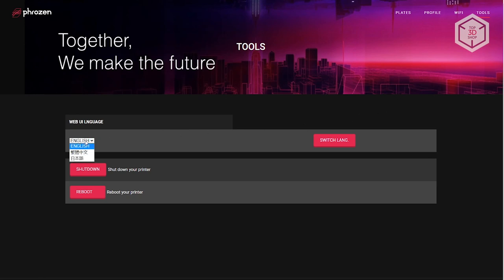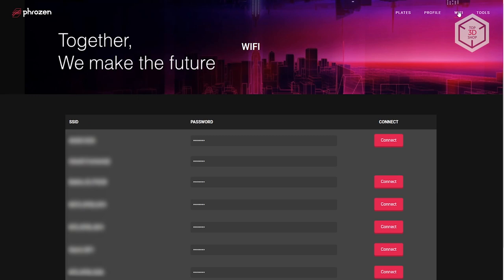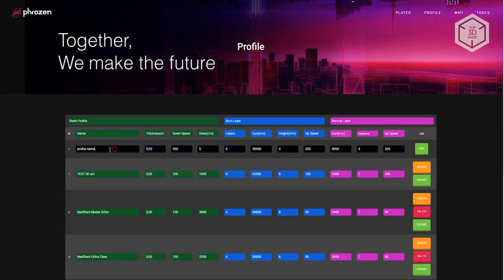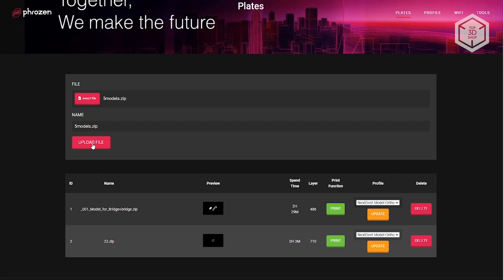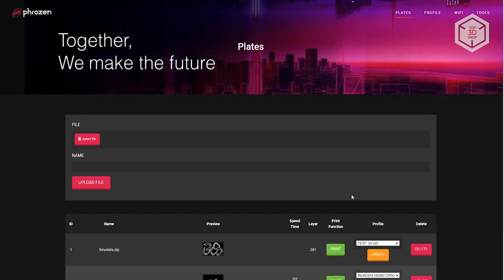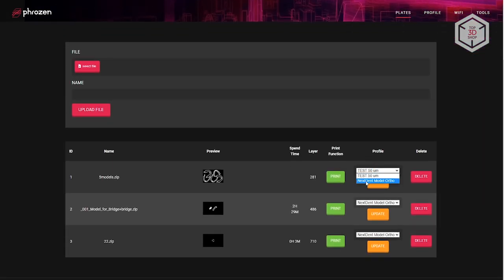The web interface contains four tabs. Tools allow you to change the language, turn off and restart the printer. The Wi-Fi menu lets you select and connect to a Wi-Fi network. Profile is responsible for creating, editing, and storing print profiles for different resins. And the Plates tab is used for loading sliced models into the printer. Here you can also select the resin profile and run the file for printing. In our opinion, downloading files and printing via the web interface is the most convenient sequence.